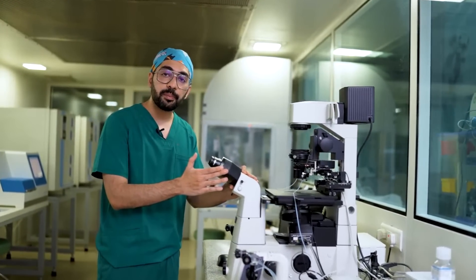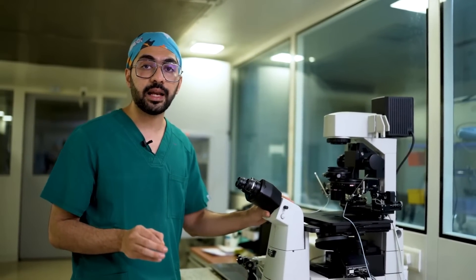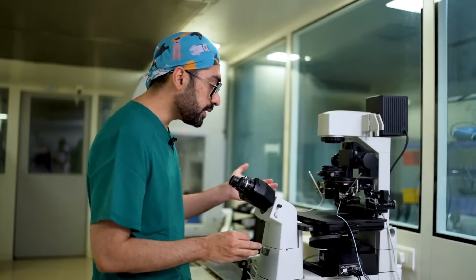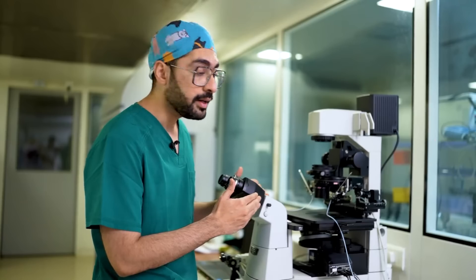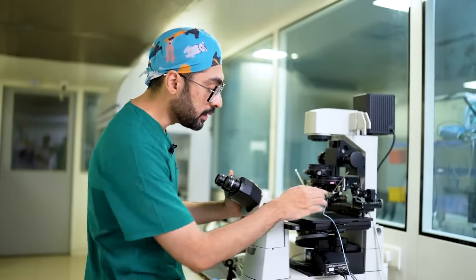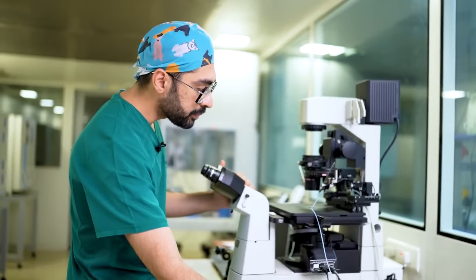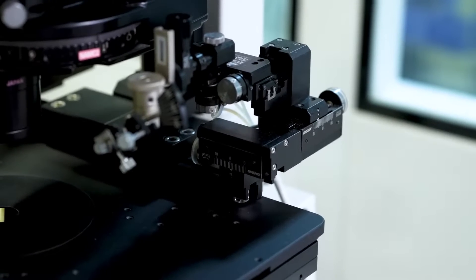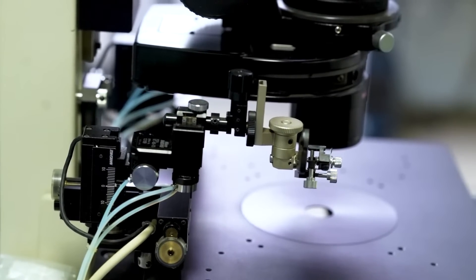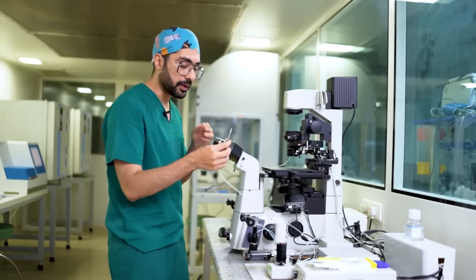Whenever we're setting up a micromanipulator, the first thing we have to understand is that we need to get the alignment proper. There are three axes on the micromanipulator — X, Y, and Z — and all three need to be centered. If you notice, there are certain markers on it. I'm going to first center the whole machine so that everything is centered, and after that I can start the alignment process.